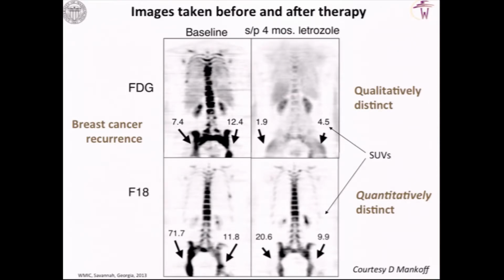So this is one example where having the image before and after therapy gives you more information than just looking at the images separately. Because if you looked at them separately, maybe with that second image, you may think that the person was still in a disease state.